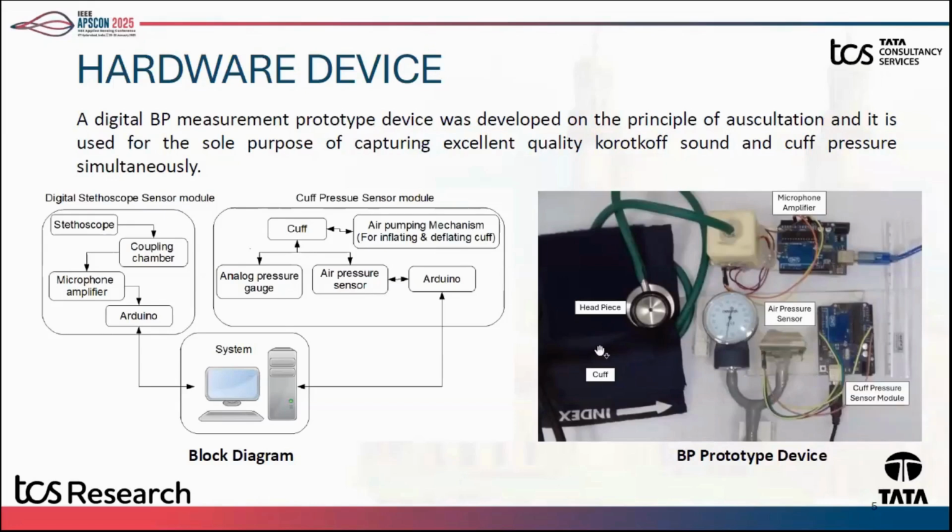The other output of the cuff is attached to a digital BP device. That device is based on the oscillometric method. There are many cuff-based, oscillometric-based BP devices in the market, and we are using both devices simultaneously so as to validate and compare our BP prediction method.